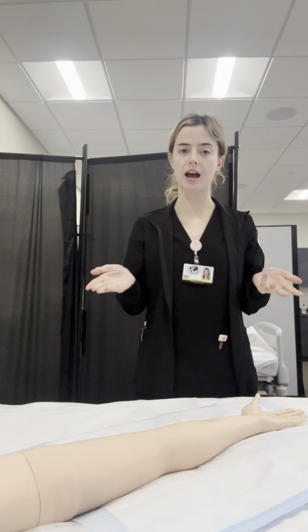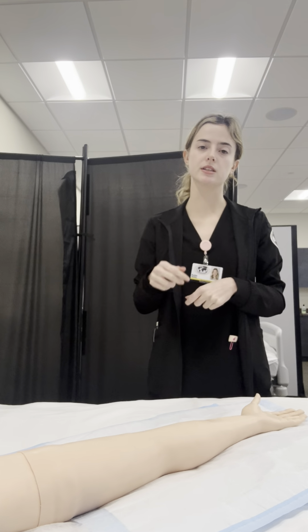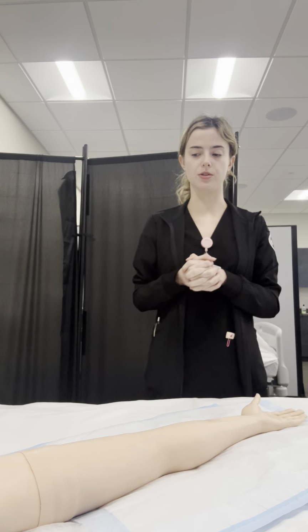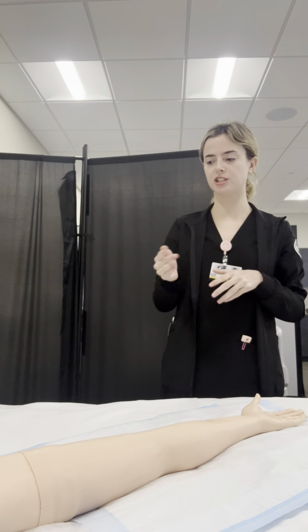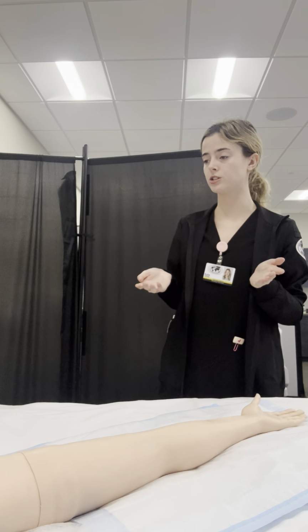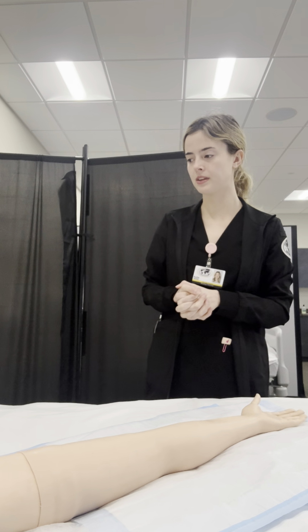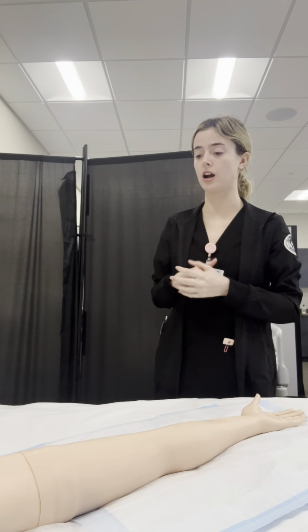Okay, so patient has verified their identity. I would also be holding the MAR against their bracelet, checking to make sure that both of those line up. So patient has verified their ID. So now I'm going to explain what I am here to do. So your provider has ordered to start an IV. So I'm here to do that for you. Is that all right? Okay, so the patient has consented for me to start their IV.